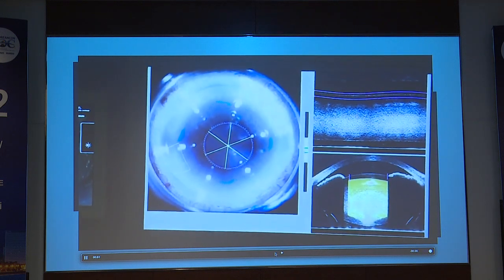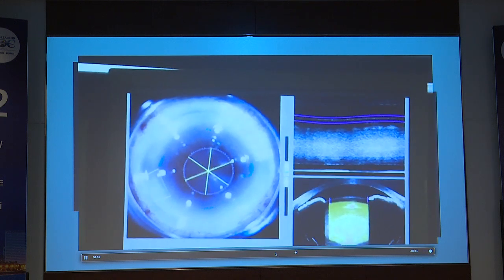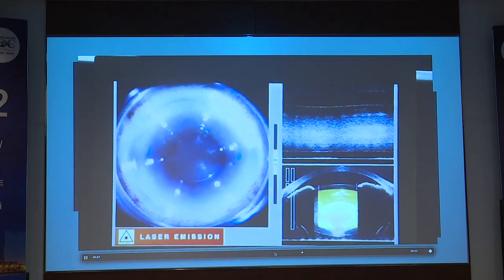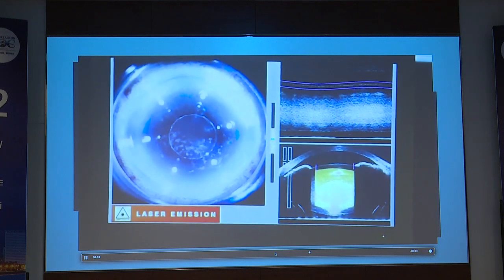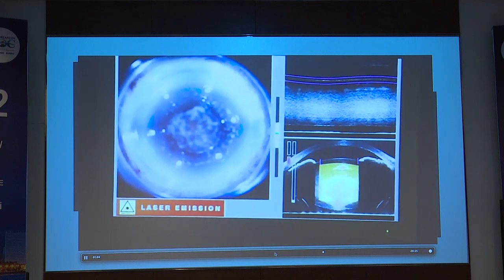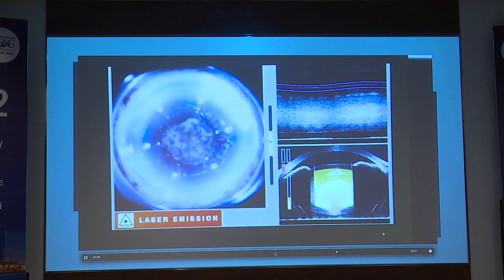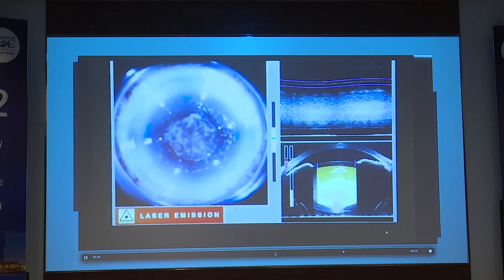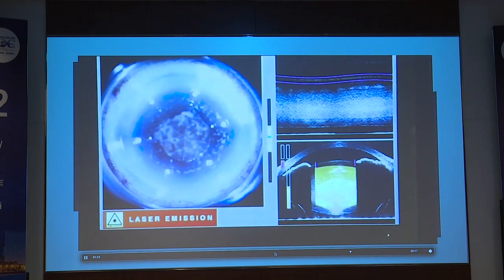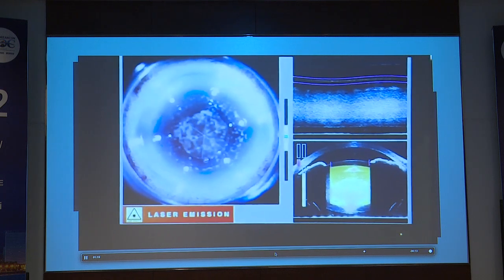Look at how big the cataract is. As I said, it's almost going to the retina. That's how big it is. And this is a one-eyed patient. Brown cataract. So a nightmare for any surgeon. But once you have a rhexis, you have a decent exposure to the nucleus. You have a fragmented nucleus, which when you go in becomes a lot easier for you to eat it up.